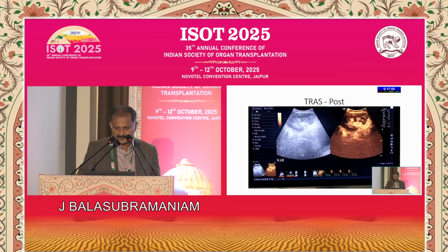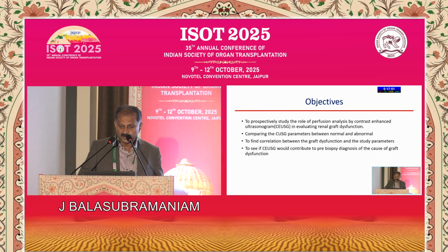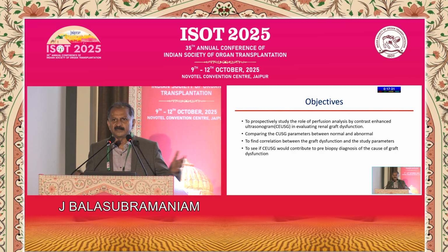This was an unusual case because we had difficulty getting hold of renal stents, and we used cardiac stents, and this was discussed in one of the recent forums, the Inform forum. So with these basic observations, I thought I should do some in-depth study of these patterns and try to identify patterns and some statistically significant method to differentiate between different causes of graft dysfunction.